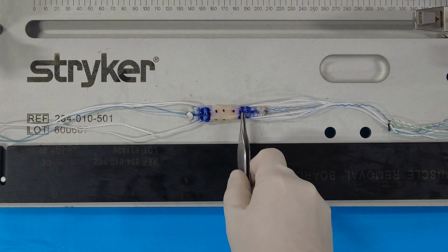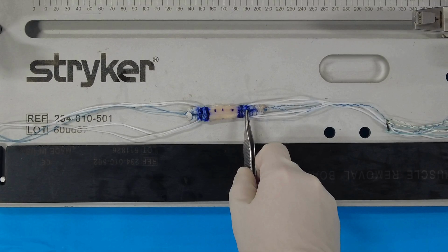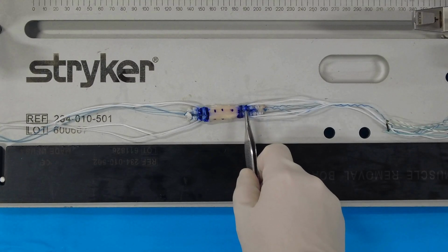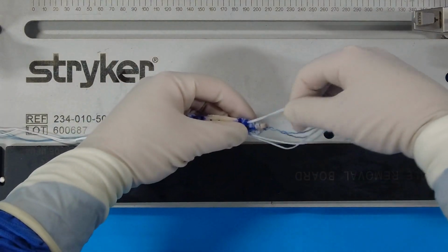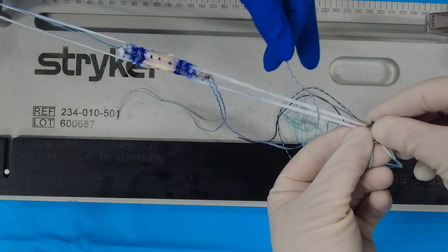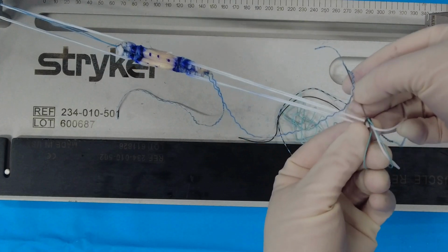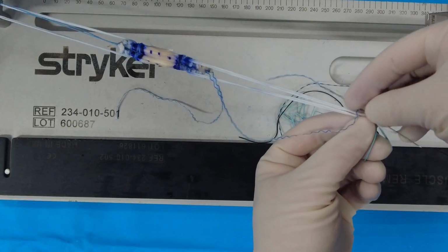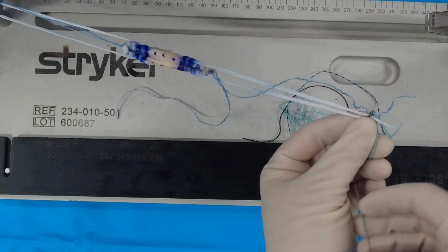As mentioned previously, once you pass your suspensory device into the graft, you're going to have a very length stable construct that's going to be similar to aperture fixation, where the tension is going to be much closer to the knee itself at the entrance of the tunnel, with your whip stitches going to the nose, so that you can help guide it in but also act as backup fixation. And so you can pass those whip stitch ends into your button, whether you use a Keith needle or other device to put that through.